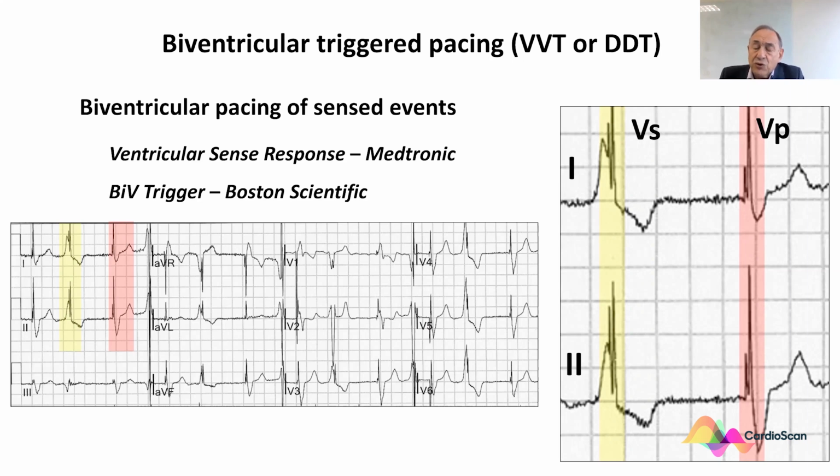The objective is to try and pace the ventricle in patients who have frequent ventricular ectopics, so as to overcome the negative aspects of these ventricular ectopics. But because they are quite late, I doubt if they are physiologically important.